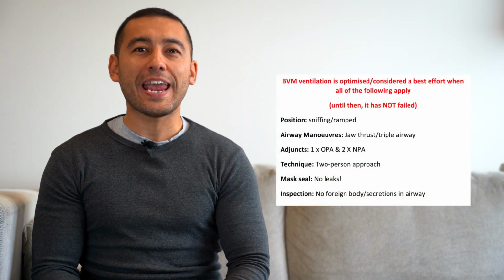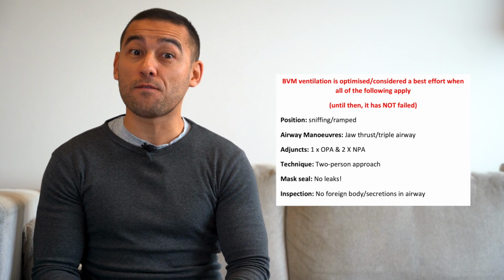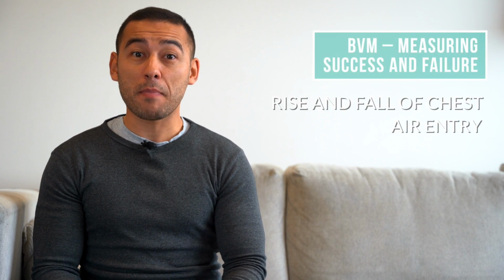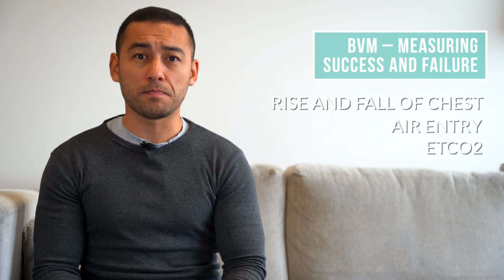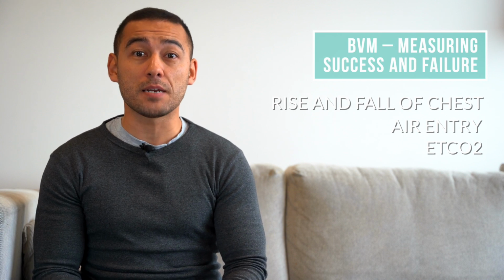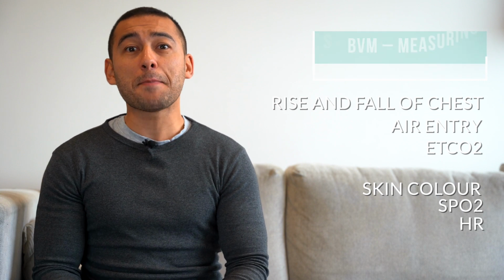After doing absolutely everything you can to optimize BVM technique, it is imperative to measure whether it has succeeded or failed at ventilating and oxygenating the patient. Successful ventilation can be indicated by adequate rise and fall of the chest, confirmation of air entry via chest auscultation, as well as a normal end-tidal CO2 waveform. Successful oxygenation can be indicated by normal skin color, SpO2, and heart rate. If these indicators are present, then bag mask ventilation has been successful and should be maintained until the patient wakes up. If, however, these indicators are not present, then bag mask ventilation has failed and a quick transition to a supraglottic airway must occur.